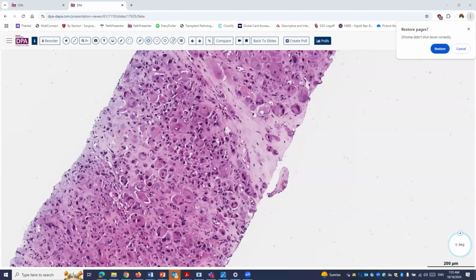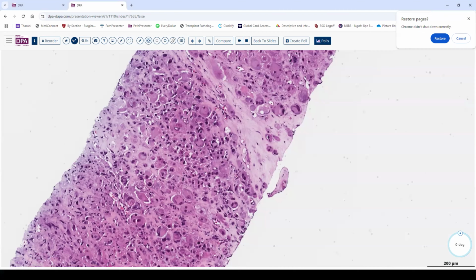Slide is not visible. I'm sorry? Slide is not visible. Oh, sorry. Okay, let me come back here. I have to do the reshare, of course. So thank you for catching me. Okay, that should be better. Over here, just check. Yes. Okay. Thank you very much for catching me on that.